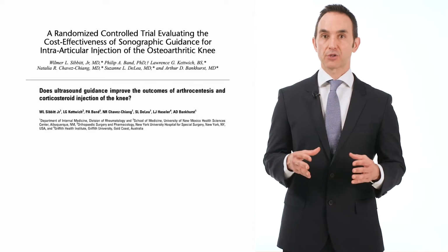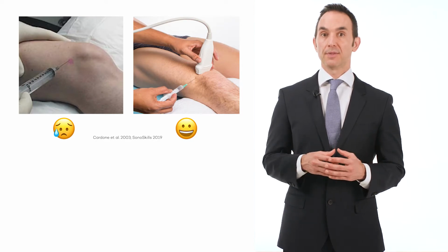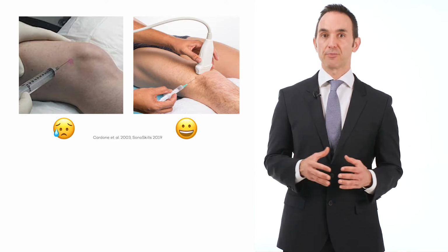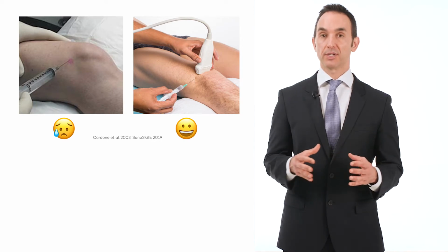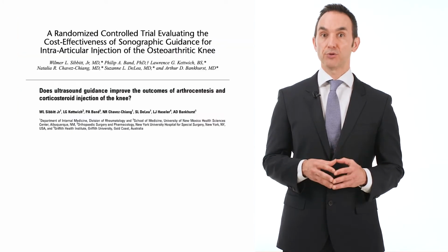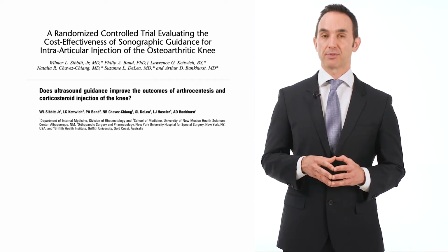A number of studies have shown increased effectiveness of ultrasound-guided compared to landmark-guided injections in the knee joint. There was less procedure pain, reduction in absolute pain scores, and increased therapeutic action of a corticosteroid injection in patients with inflammatory arthropathy who had ultrasound-guided injections. Improved accuracy seems to equate to improved efficacy in the knee, especially in inflammatory arthropathy patients.